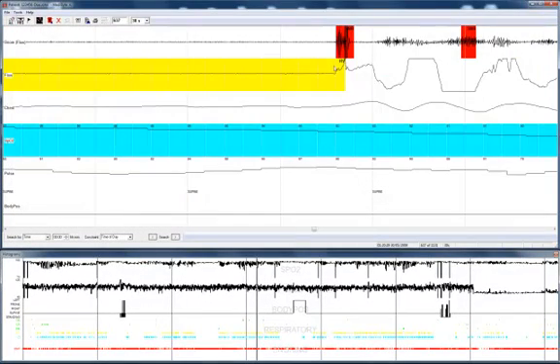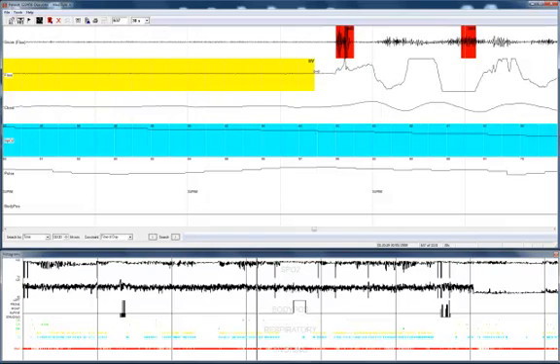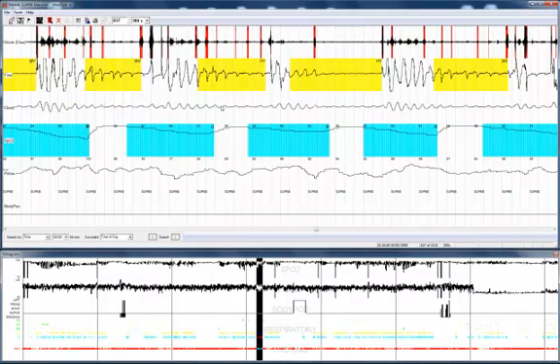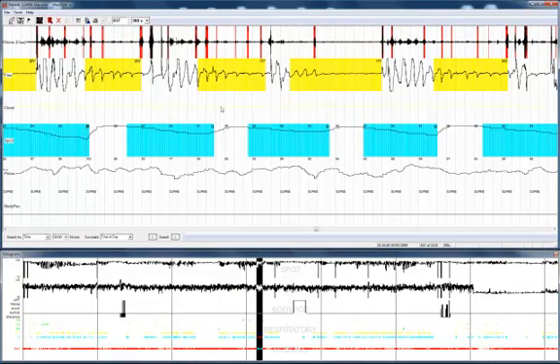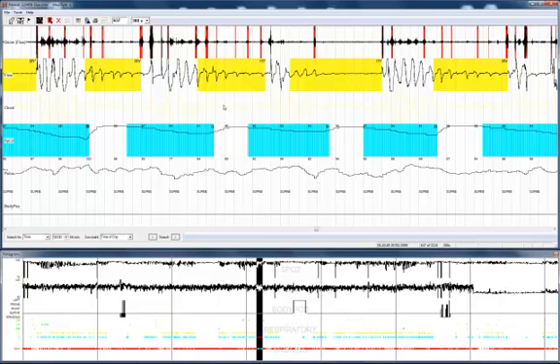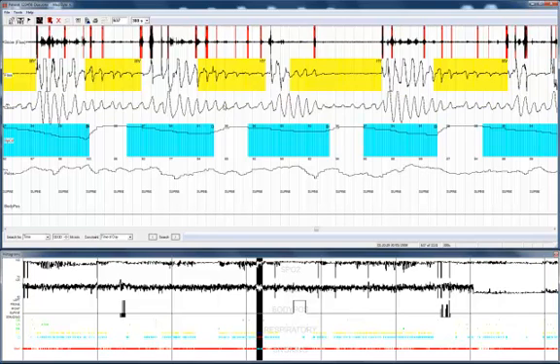If you wish to increase the display of one particular channel, hold the control key down and double left click on that particular signal. You'll notice the color changes. Now press the up arrow. I pressed it twice. Press the escape key and you'll notice that it looks larger in appearance. If I press the scale display button now, it will change again.